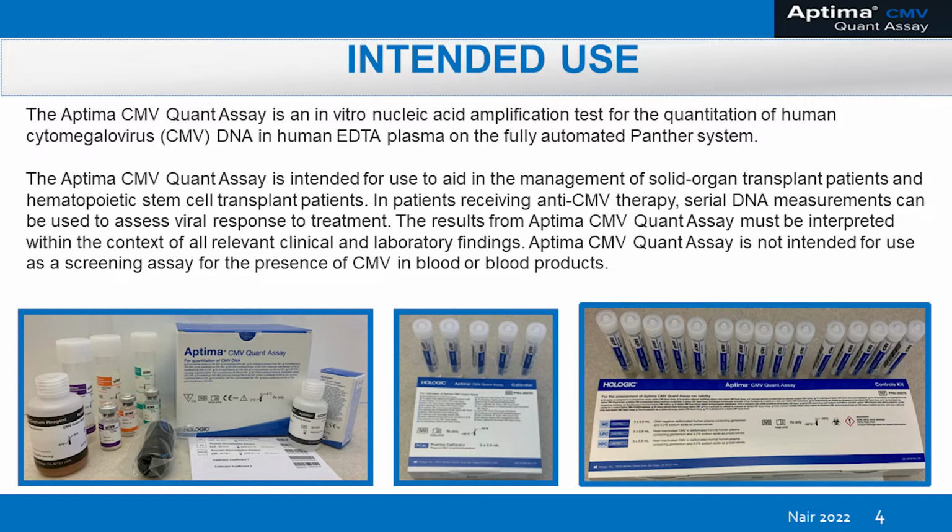And as you've seen from the third international consensus guideline, there's no threshold for triggering treatment for CMV patients. In the absence of that, serial monitoring of CMV viral load is the way for managing such patients. For Aptima CMV Quant, the assay is composed of a reagent kit of assay-specific reagents, as well as a box of controls.